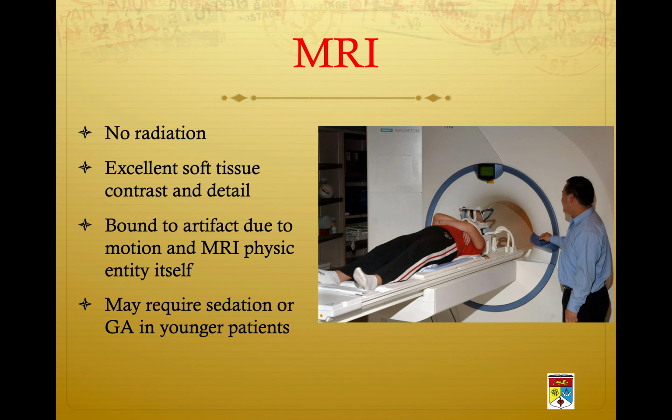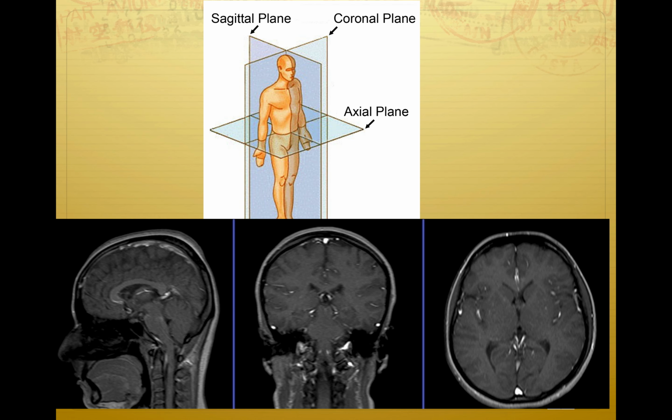I mentioned the MRI: no radiation, and good tissue contrast detail. It can have some artifacts because of the MR itself. But the thing about MR is that it requires sedation or even general anesthesia in younger patients.